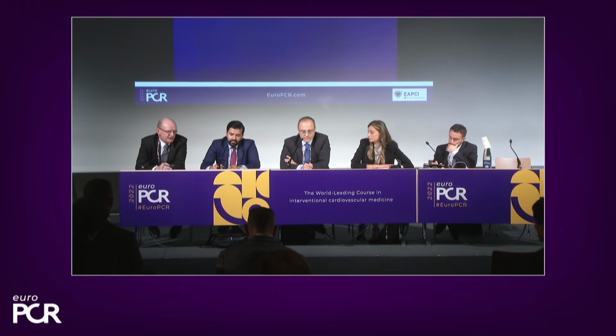Now, one of the great things about PCI is we all have opinions, and sometimes there are things we all agree on, and other times there are things none of us agree on. I would have had a wire in that diagonal, personally. Yeah, for my first stent, and then I'm going to put the wire back into the circ. I might have used 3 wires, but I'd have had a wire in the diagonal all the way through, personally, just so you can mark it. There's some sense, I think, that perhaps they help keep it open, but probably the most important thing is it just marks it.